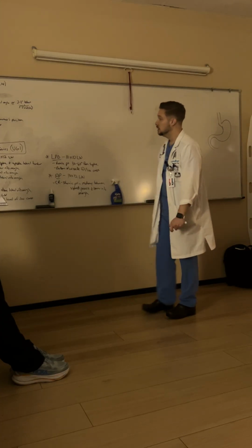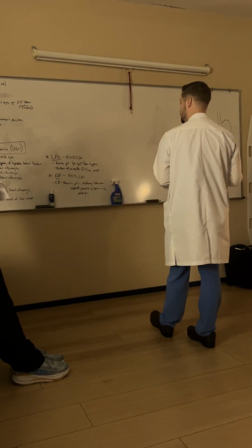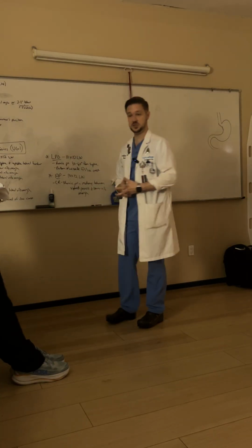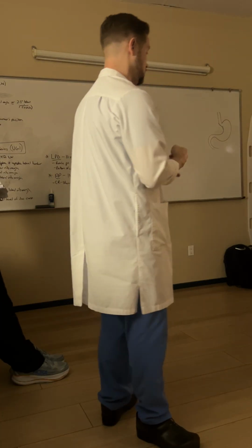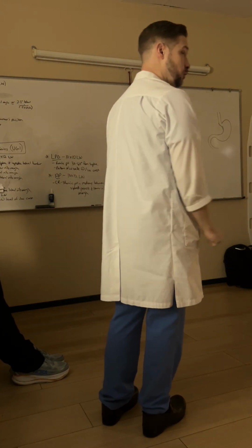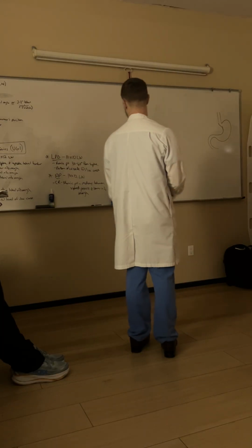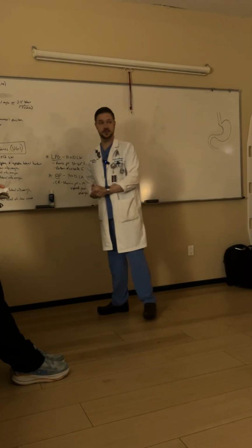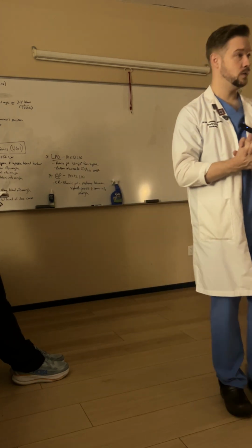Okay. And then finally, an AP or a PA. Okay, AP would be preferred, just again for ease of the patient drinking the contrast media and having the contrast flow through the stomach. Okay, well, actually, for the AP, it's going to kind of sit in the fundus, but that's fine. Okay, so that's what we're going to work on first, the esophagus.